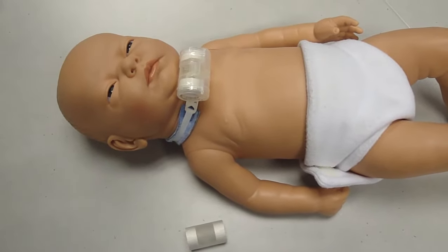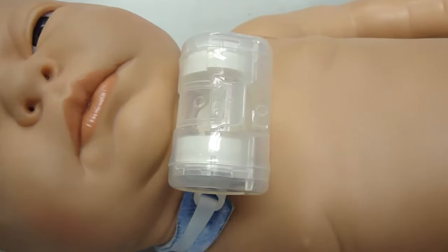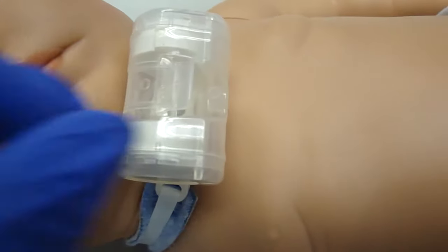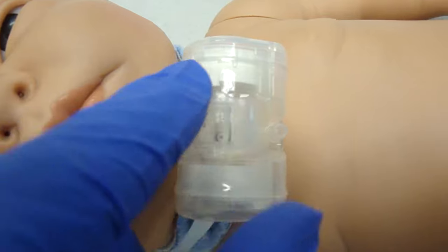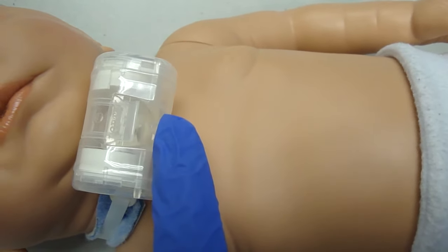There are different kinds of HMEs, heat moisture exchangers, or artificial nose. This device has filters on either end. It has a little port on top that you can open if you need suction. And there is a port here in case you need to add supplemental oxygen.